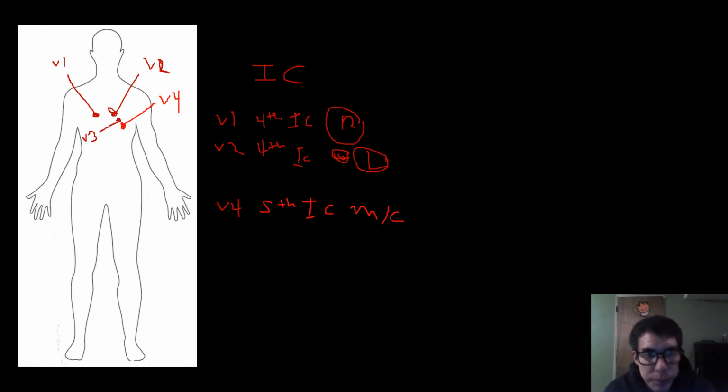V3. I'll write it here, between 2 and 4.